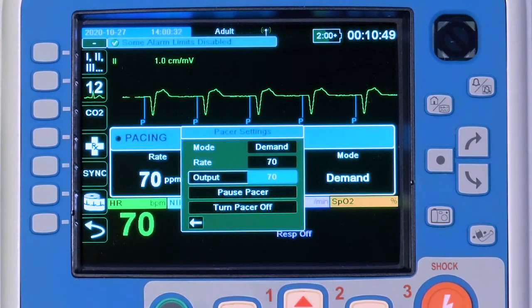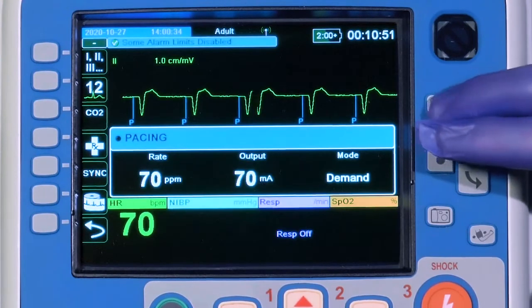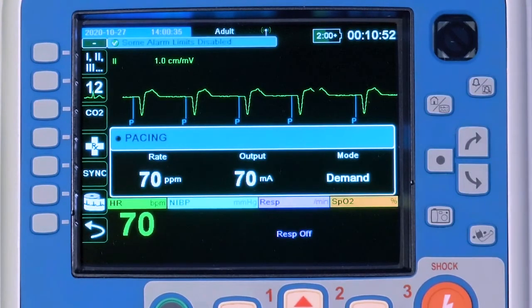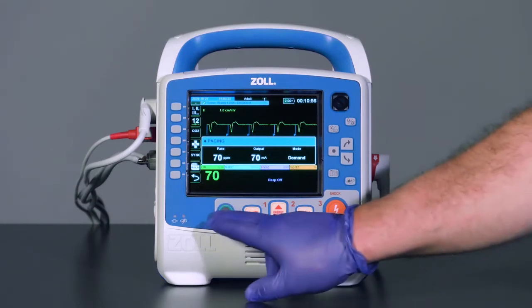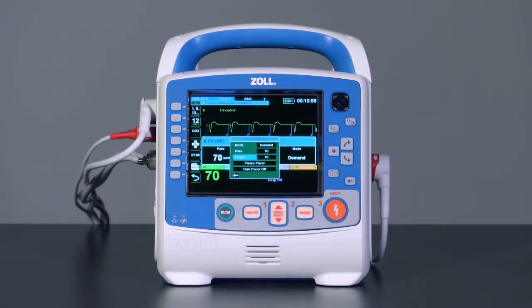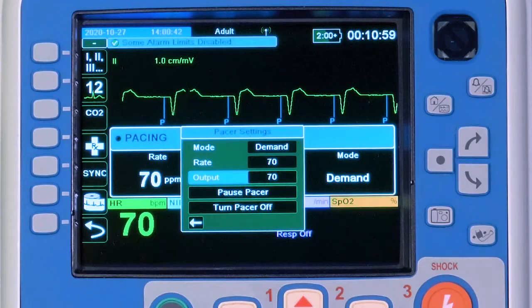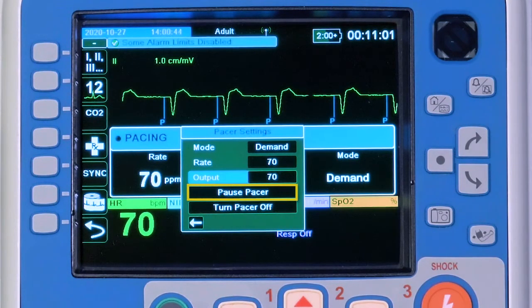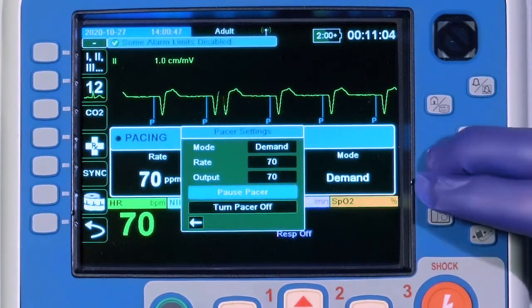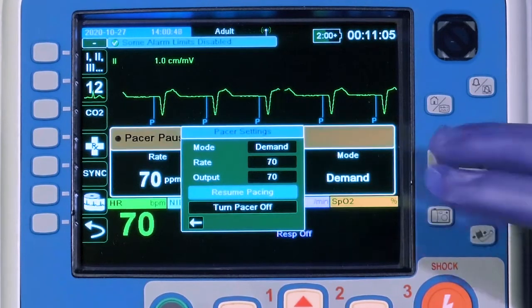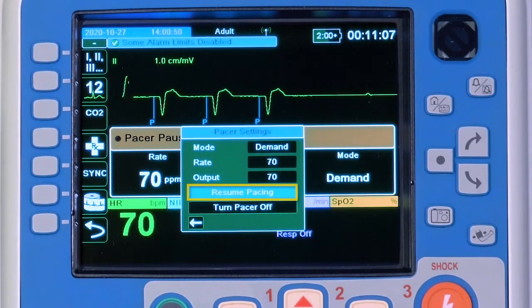Selecting either Home or Pacer buttons will remove the pacing menu. The pacing menu can be accessed again at any time by selecting the Pacer button. In the pacing menu there is an option to pause Pacer. Pausing the Pacer results in an indefinite pause. Select Resume Pacing to resume.